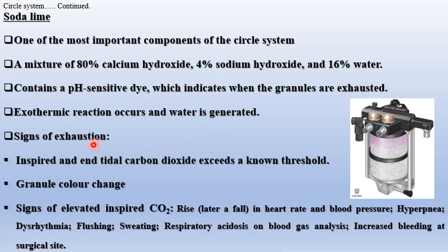You should know the signs of exhaustion. First, inspired and end-tidal carbon dioxide, as demonstrated on the capnography, which is a monitor connected to the patient, exceeds a known threshold. The granules will change in color. Signs of elevated inspired carbon dioxide can be detected later, like a rise, later a fall in heart rate and blood pressure, hyperpnea for a patient spontaneously breathing, dysrhythmia, flushing, sweating, respiratory acidosis on blood gas analysis, increased bleeding at surgical sites.